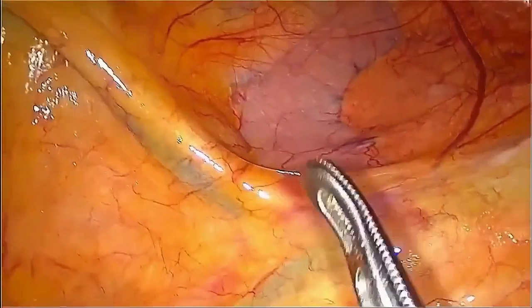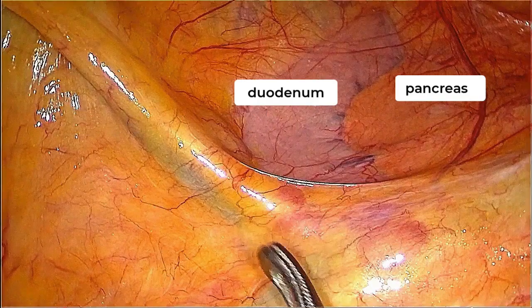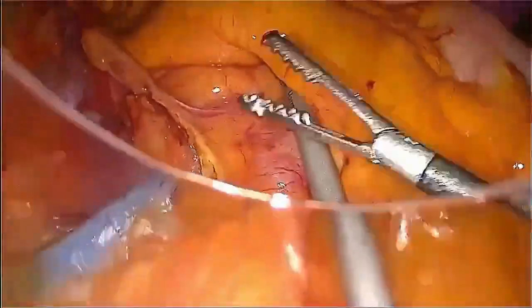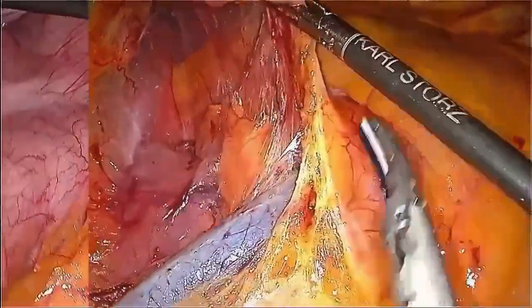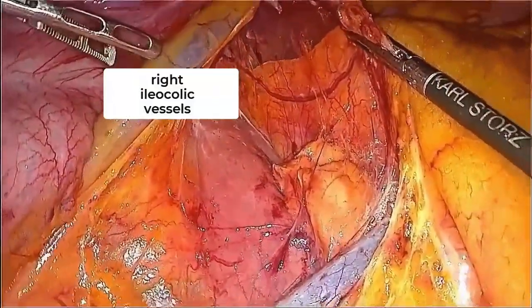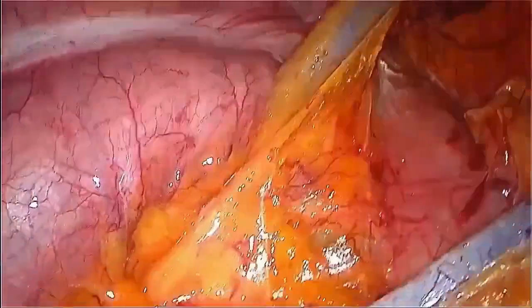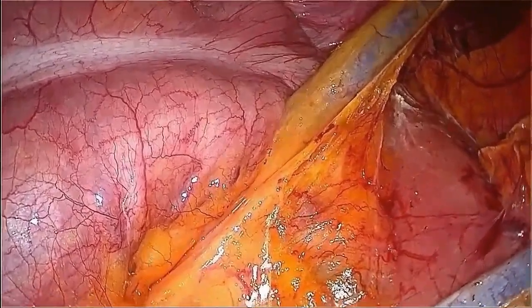In thinner patients, such as in this case, it is possible to see the duodenum and the head of the pancreas above them. After the section of the ileocolic vessels, the retroperitoneal dissection continues over the anterior wall of the duodenum. During this dissection, the right colic vessels can be observed in most cases, which are located transversely over the second portion of the duodenum.